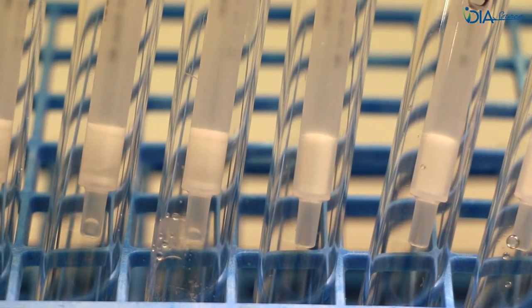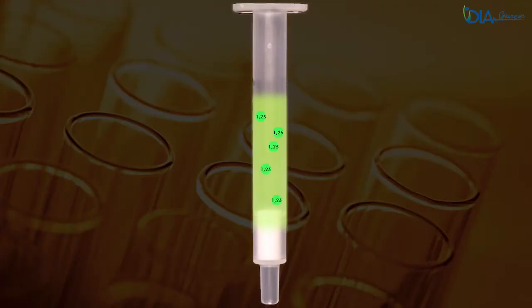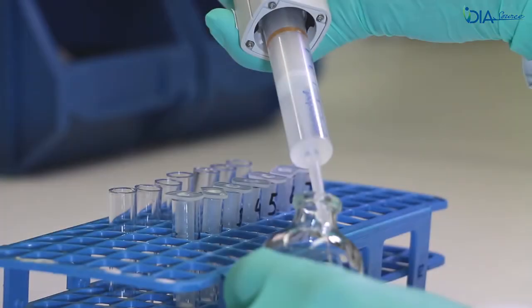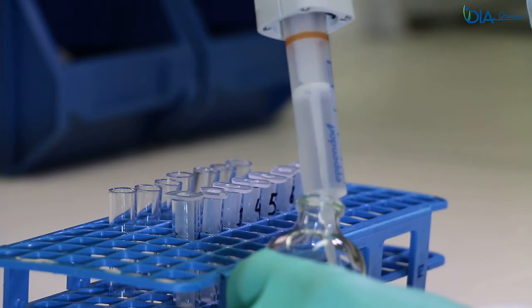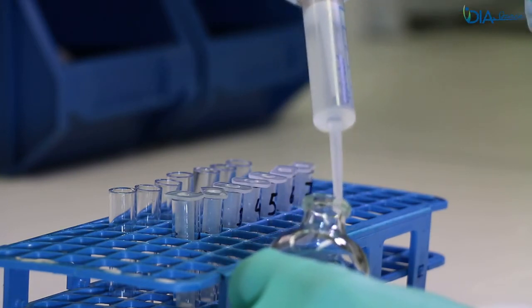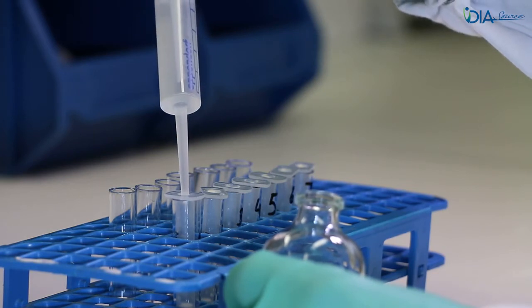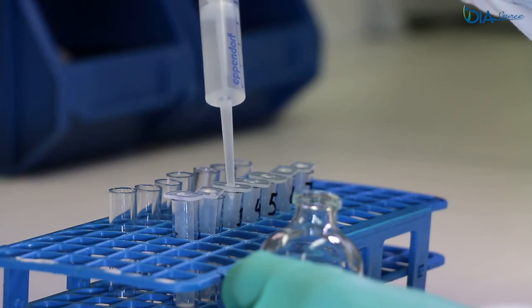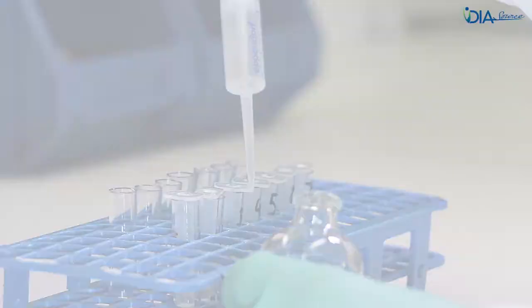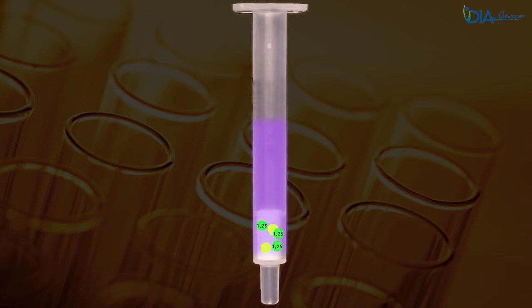Wait a few more minutes in case of any doubt. 1,25-dihydroxyvitamin D and some other similar molecules are retained on the silica phase. Add 1 milliliter of the washing solvent using the pre-saturation technique. Let draw by gravity during 10 to 15 minutes. Move to the next step when there is no visible liquid on top of the silica; wait a few more minutes in case of any doubt. Potentially interfering molecules are washed away from the silica phase.